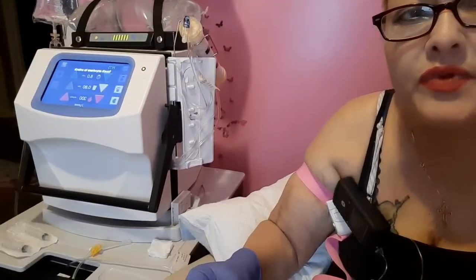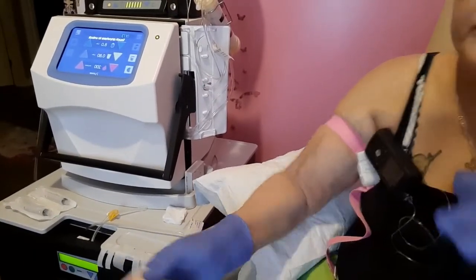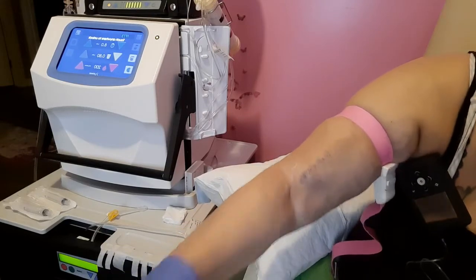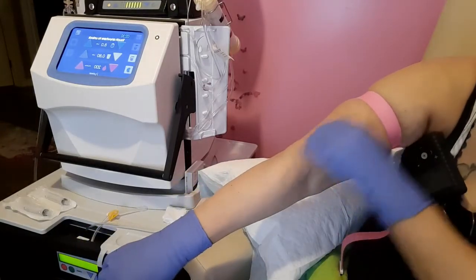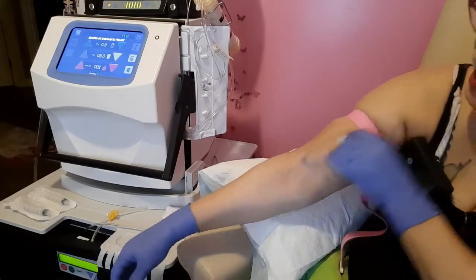I'm going to try to zoom you in. I guess I can't zoom in this way. Well, y'all just have to watch it this way, I guess. I have to turn the camera around in order to zoom. There's a thought, camera people. All right, so for 1 minute, we have to sterilize with the alcohol prep pad, or 2x2.